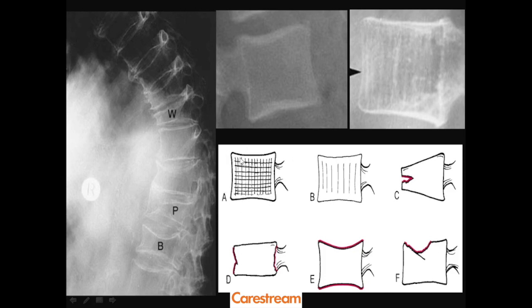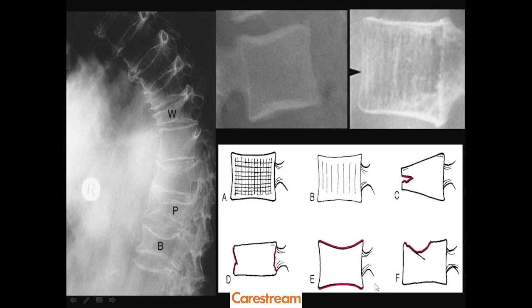A normal vertebral body shows a criss-cross of horizontal and vertical trabeculation. In osteoporosis, preferential resorption of horizontal trabeculae makes the vertical ones stand out giving a striated appearance. Anterior wedging shows reduction of the anterior vertebral body height while posterior height is maintained. When both anterior and posterior height is lost, this is vertebral plana. Bone softening causes end plate depression on both sides, giving rise to a fish vertebra or biconcave vertebra. Angular end plate fractures also occur. Because of varying degrees of vertebral height reduction, a kyphotic spine develops.